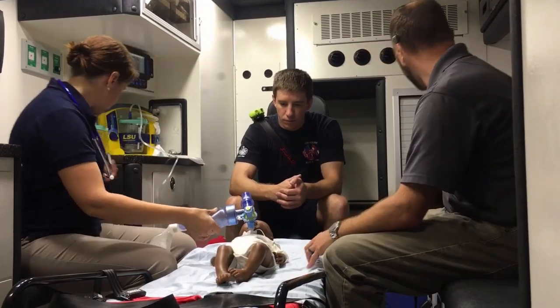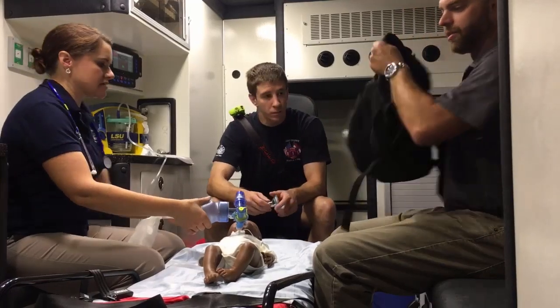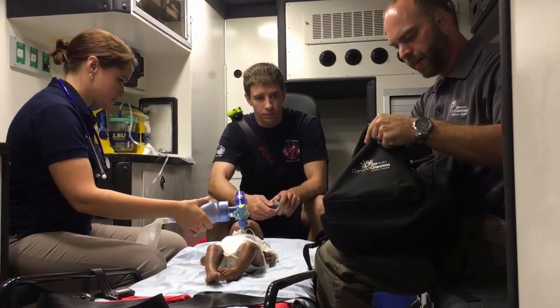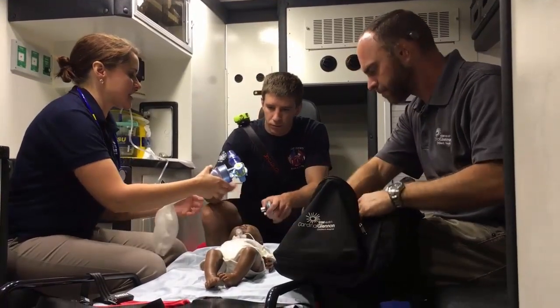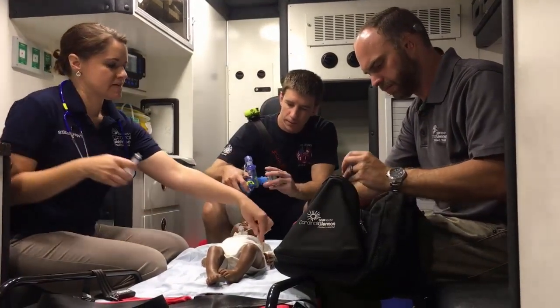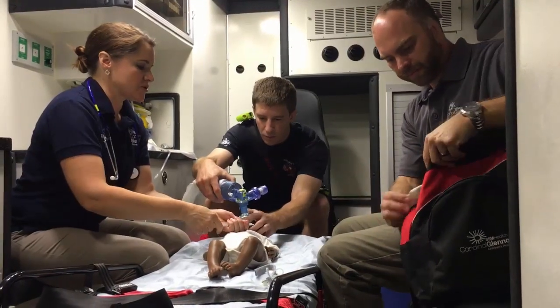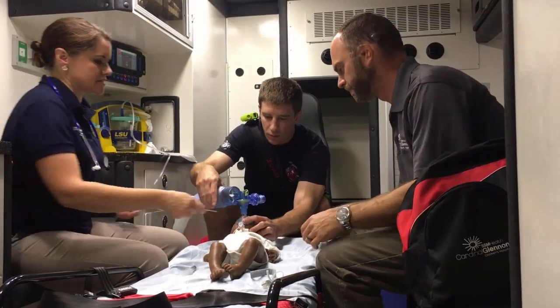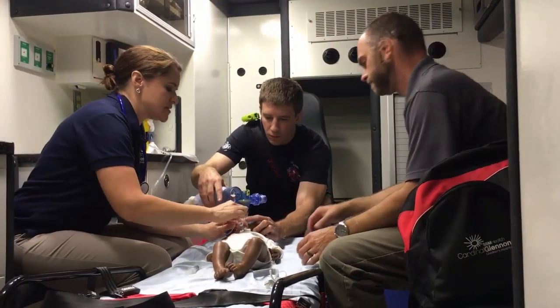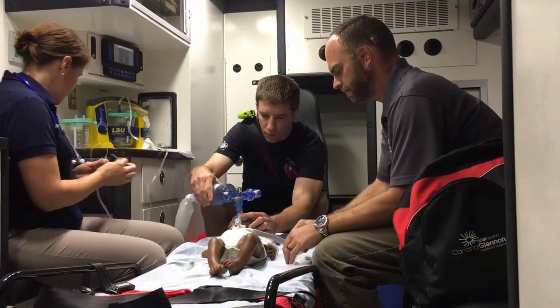Let's get her supplies ready. I'm going to get her trach bag — all of her supplies are in here. I'm going to find that trach the same size for you. Go ahead and start bagging her over the nose and mouth. I'm going to ensure that we have this cuff deflated since we just pulled her off the vent. There's also a size smaller in here if needed. I'm going to try to suction one more time — not really getting anywhere with that.